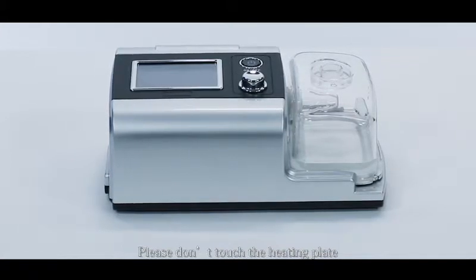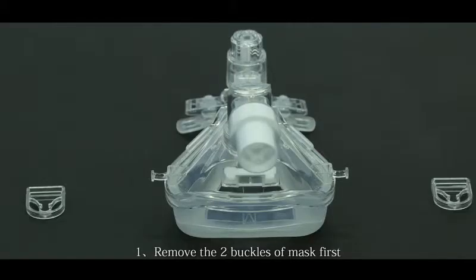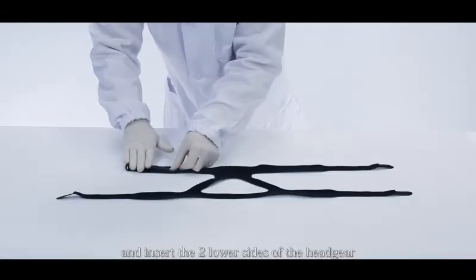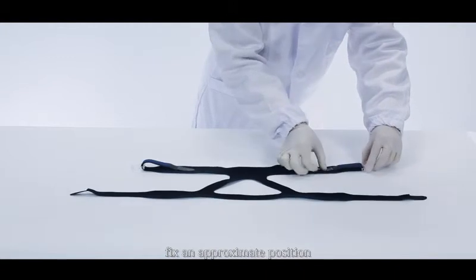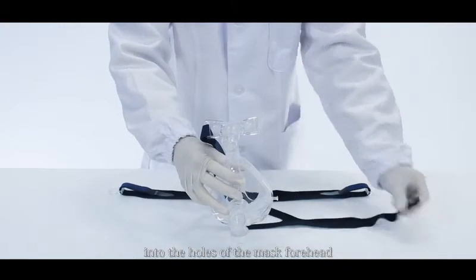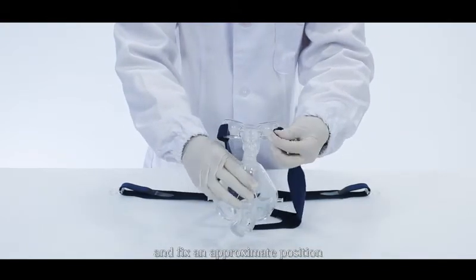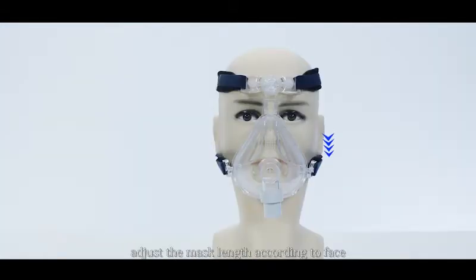Please don't touch the heating plate. Install and wear the headgear and mask. Remove the two buckles of the mask first and insert the two lower sides of the headgear into the mask buckles. Fix in an appropriate position. Insert the two upper sides of the headgear into the holes of the mask forehead and fix in an approximate position. Wear the headgear into the proper position on the head. Gently put the mask on the face. Adjust the mask length according to your face. Snap the two lower buckles into the fixing rods.